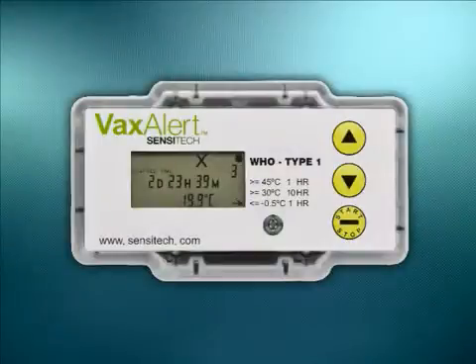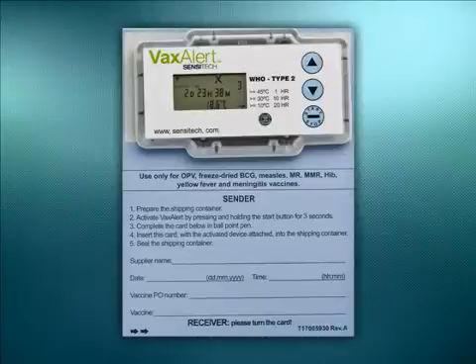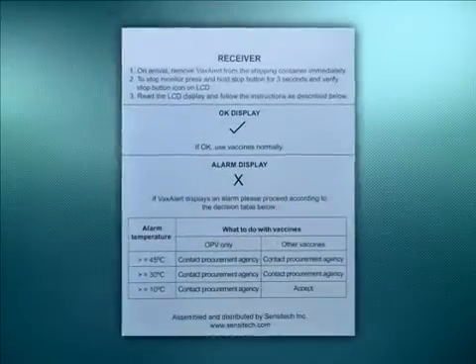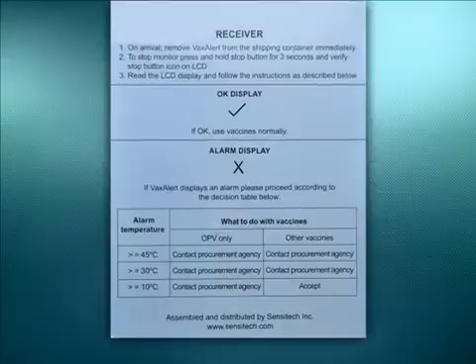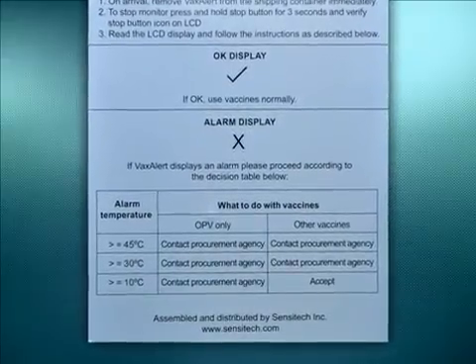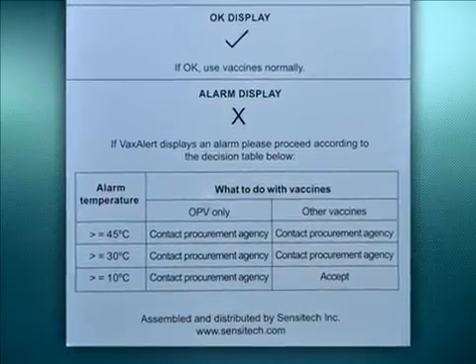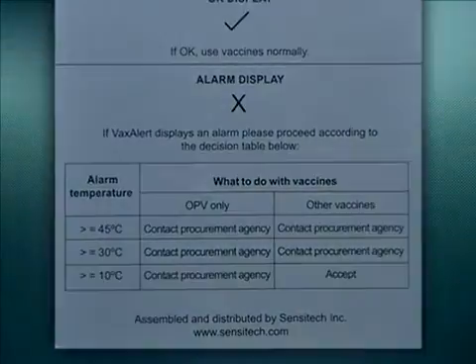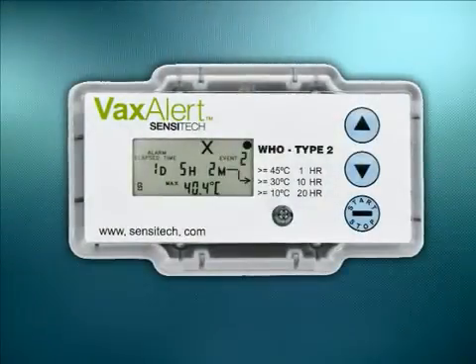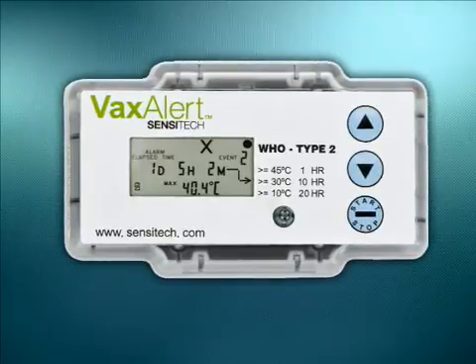During the history mode operation, the screen will return to the stop mode screen if no additional button presses are initiated within 15 seconds. If there are any alarms as indicated by the X sign, refer to the decision table at the end of the card for further instructions. Make a photocopy or scan all Vaxalert history screens, the Vaxalert stop screen, and both sides of the backing card for documentation purposes.